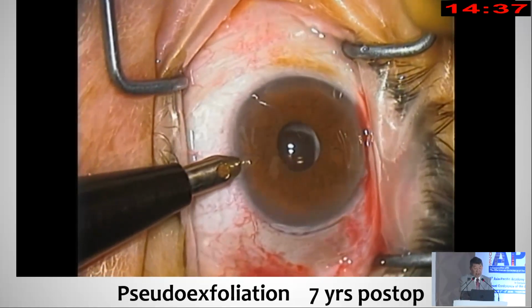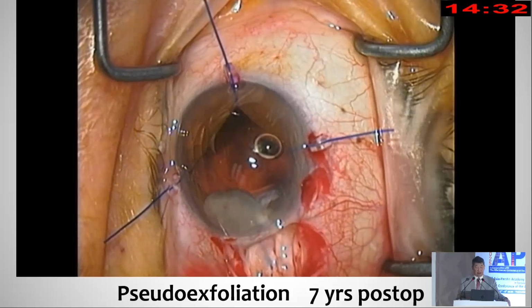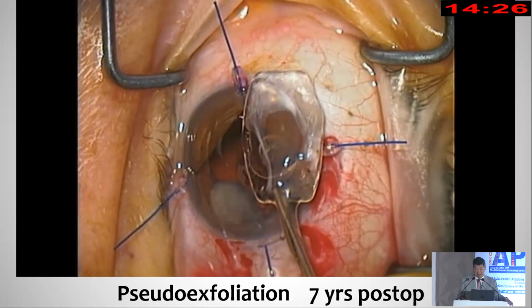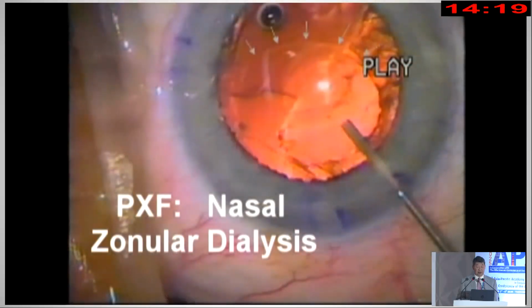So as we all know, this is the problem with zonulopathy, pseudoexfoliation: it's not enough just to get the lens in the bag, preserve the capsule. That's hard enough. We then have to worry about late bag IOL dislocation with this contracted capsule 7 years later.